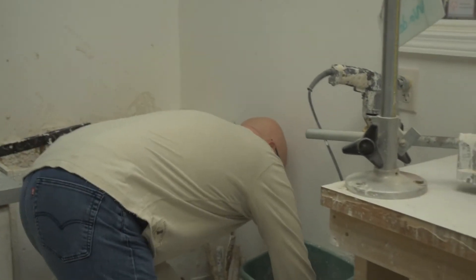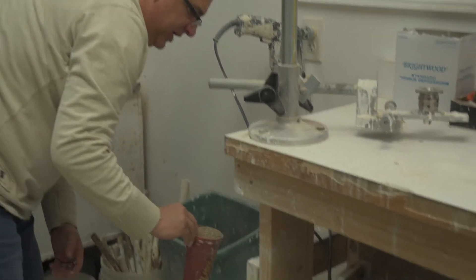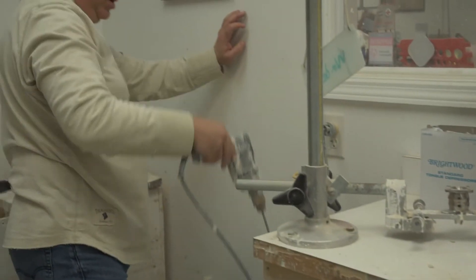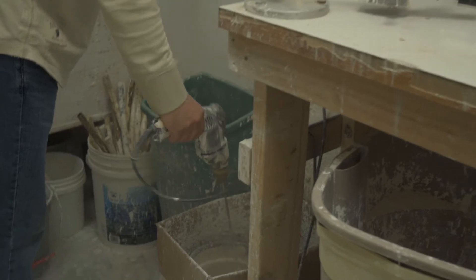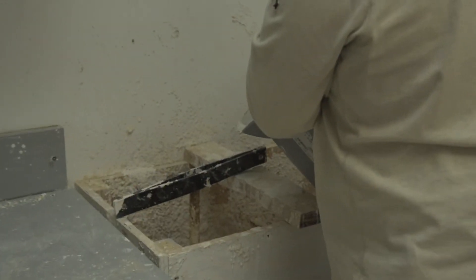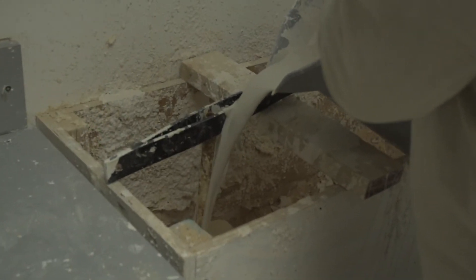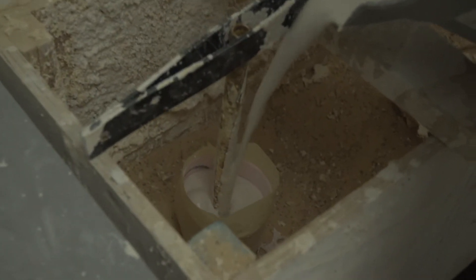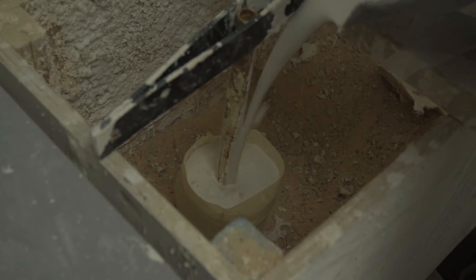This is a pretty small cast. This is vermiculite — it just makes it easier to modify. Give me a little stir, and then pour it into the cast.